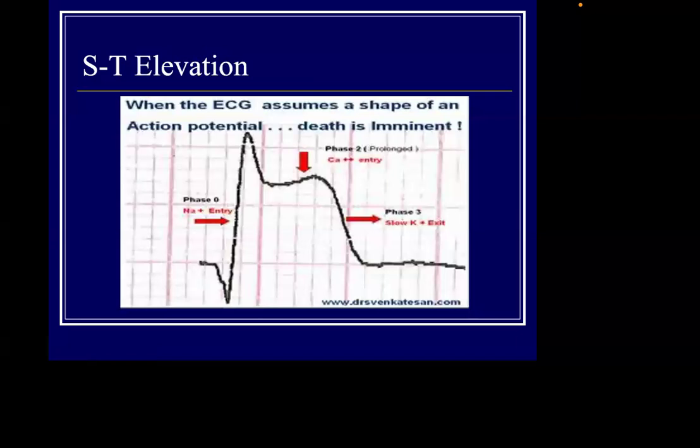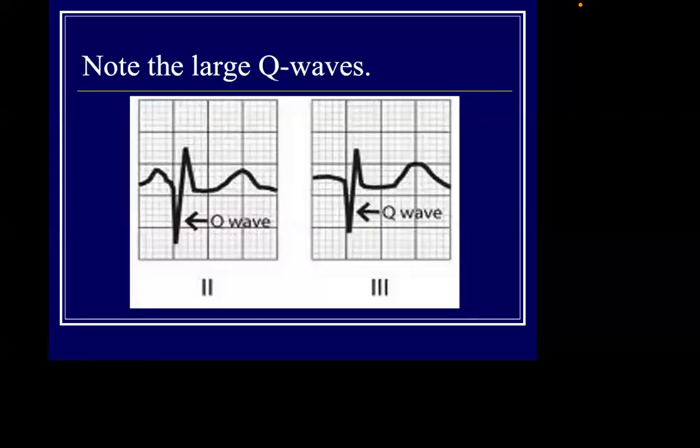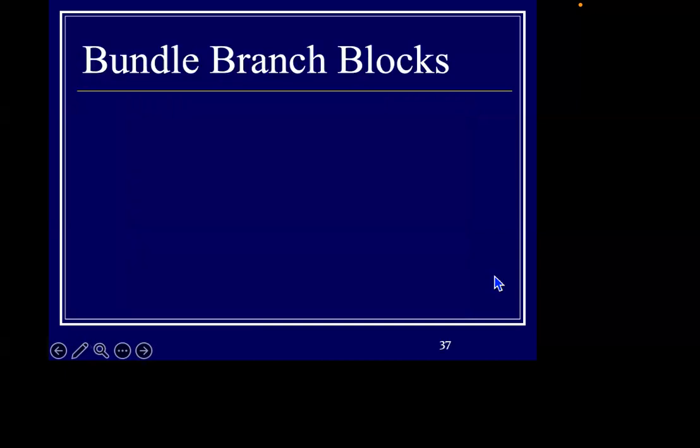And when they do the CMR, they saw some viability in the myocardium. So the concept that the Q wave in the ECG denotes myocardial infarction is obsolete. So this is the ST segment elevation, and this is the Q wave, a very clear Q wave. The first negative deflection in the ECG usually is a Q wave.